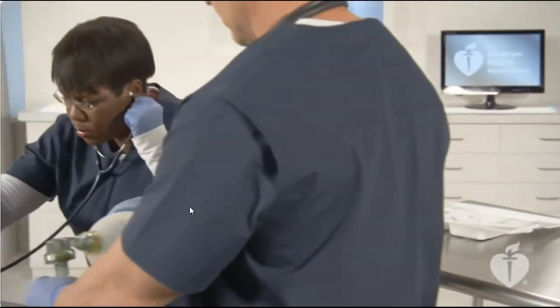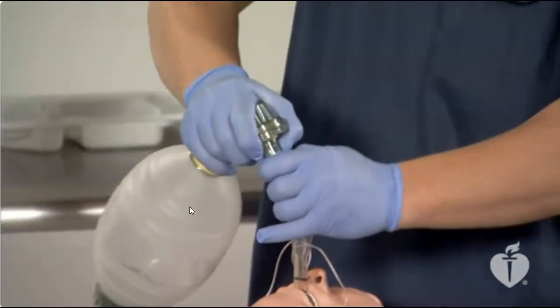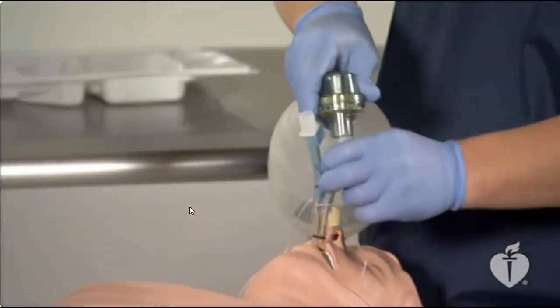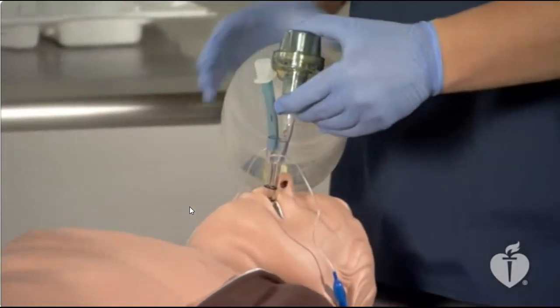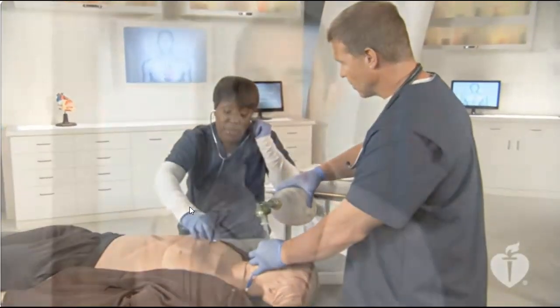However, if you do not detect chest rise or breath sounds, this may mean that the tube is seated in the trachea. Connect the bag to the clear lumen, marked number 2, and provide ventilation. Verify breath sounds and watch for chest rise. Caution, it's critical to confirm the proper placement of the esophageal tracheal tube because inflating the stomach with air can cause fatal complications.